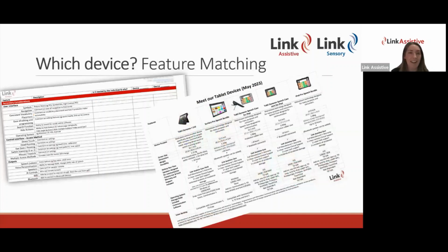So you might have a device for a 3-year-old who needs something that they can carry. They might need something lighter, versus someone who is out and about lots. They might live out in the countryside and need something that's a bit more durable. So maybe another device like the i110 is going to be more suitable.